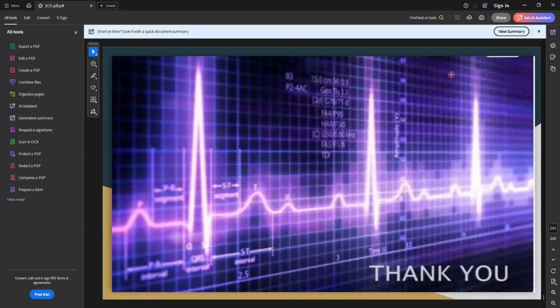In that, you will come to know whether there are any wall motion abnormalities. Most of the times when the patient presents with myocardial infarction or acute coronary syndrome, depending upon which wall has been infarcted or is going into ischemia or infarction, you will find reduced wall movement. That is, the wall movement of those ventricles will be reduced.